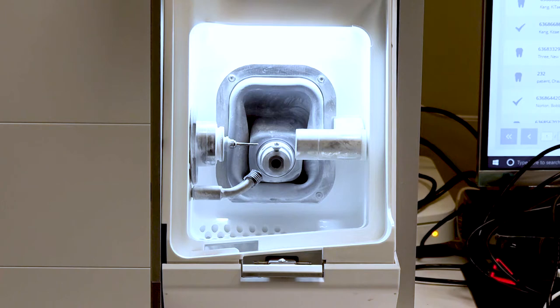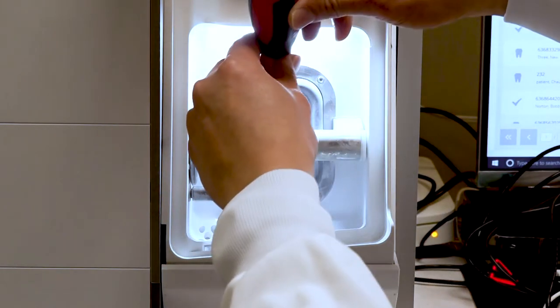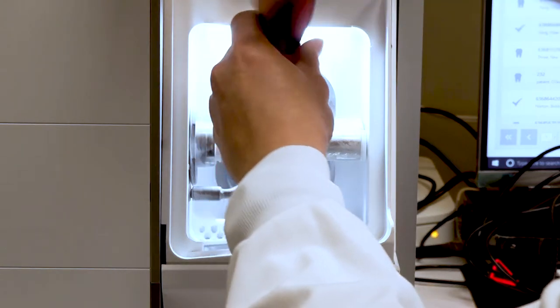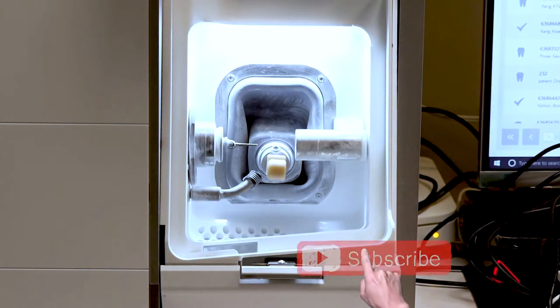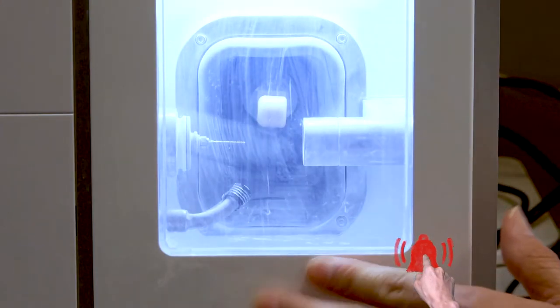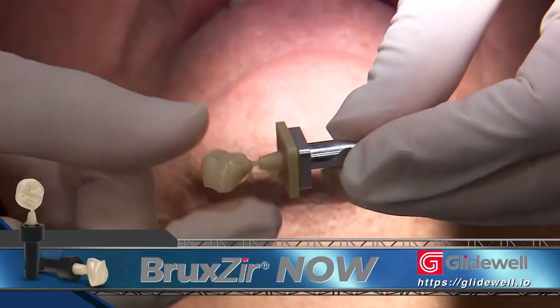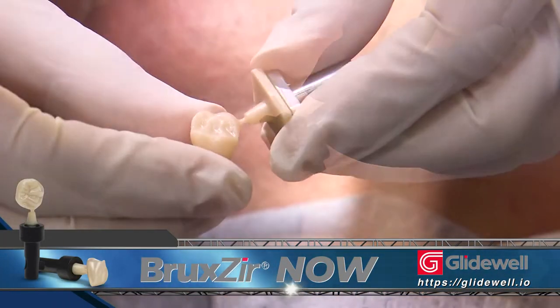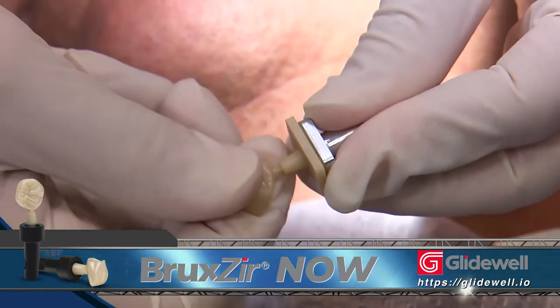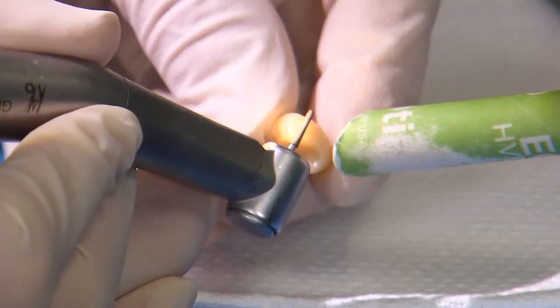When the design is complete, how does a 35-minute turnaround time for a fully sintered Bruxer Crown sound? It kind of is unbelievable and shouldn't even be possible, but I'm amazed every time. After I lock a Bruxer Now block into my Fast Mill, I get a perfect fitting Bruxer Crown that's ready to be delivered. On the milled Bruxer, I snap the crown at the thinnest point of the sprue and smooth the residual down with a fine grit red striped diamond bur.